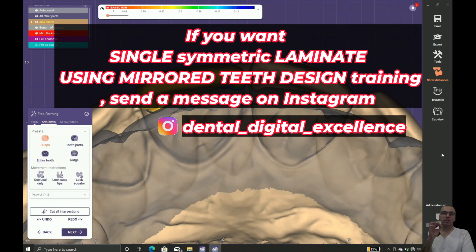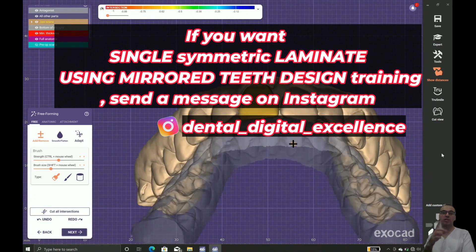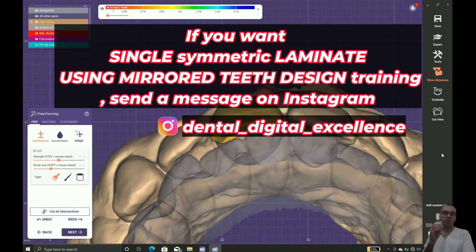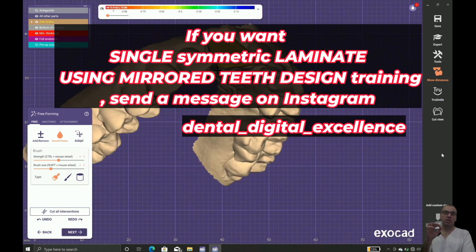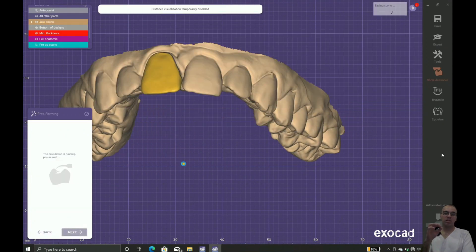In this case I'm going to make it acceptable. Comparing the margins, tooth number 11 is positioned further cervically than tooth 21 — just a small difference. I think we are good and I'm happy with my design.